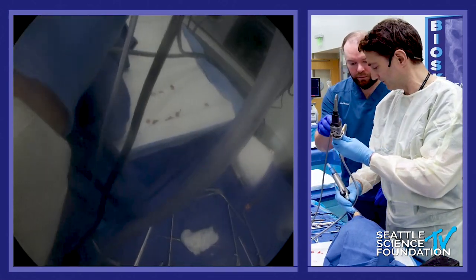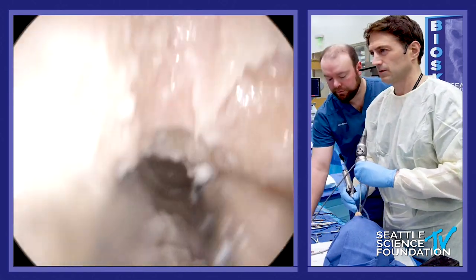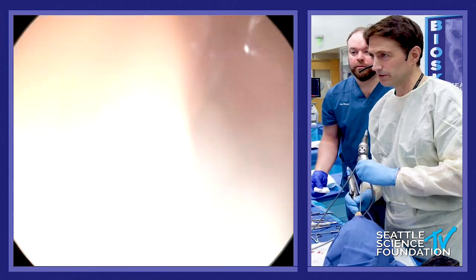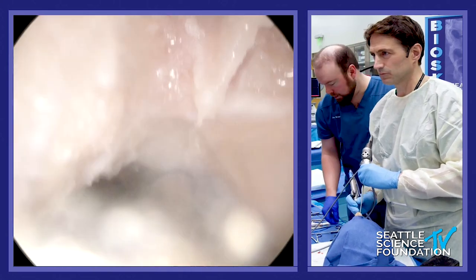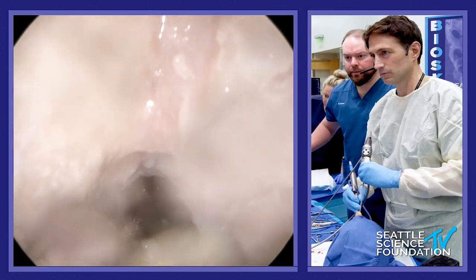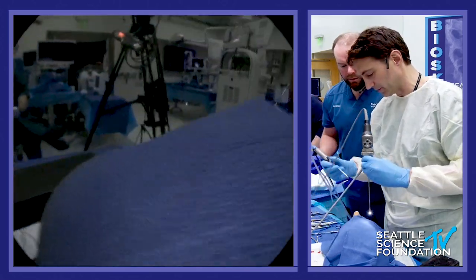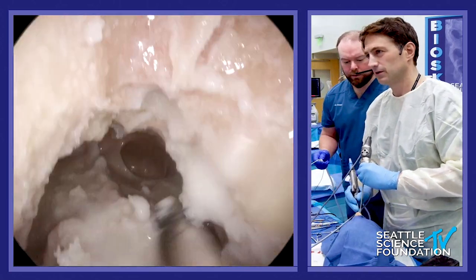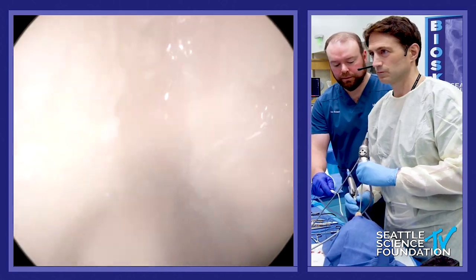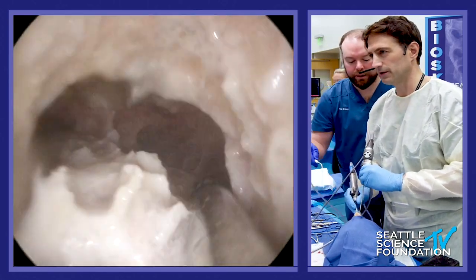Can you wipe my scope? Now pour some irrigation into the nose — it'll help get rid of some of the bone dust. See all this bone dust?